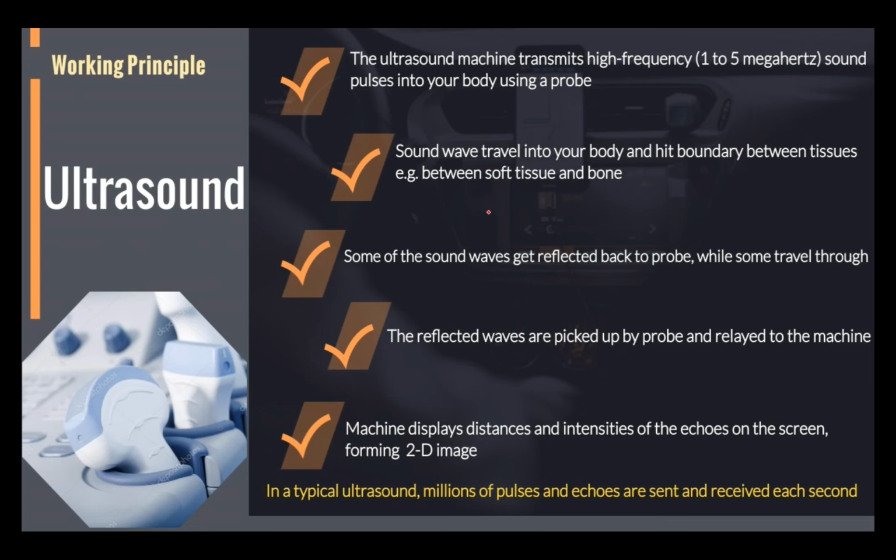Right, coming to the most important part, the working of the ultrasound device. We'll discuss how ultrasound devices work.